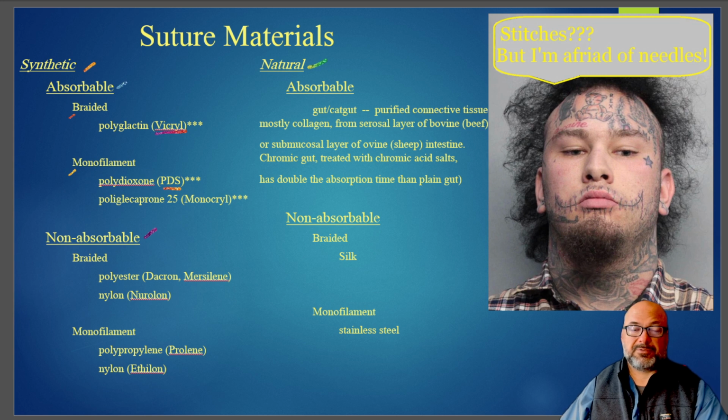We tend to use, some people use that for fascia. I think a lot of folks do. Some still use Vicryl for fascia. And then Monocryl, you'll see that used a lot on the skin, on the subcutaneous layer, and there are some folks that use Monocryl on the uterus as well.